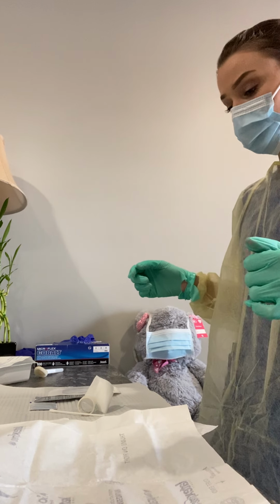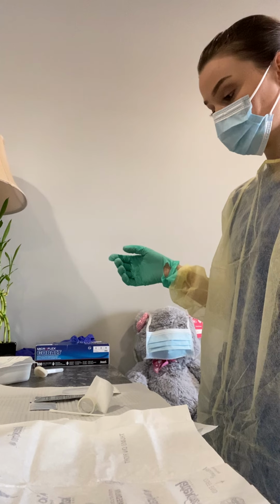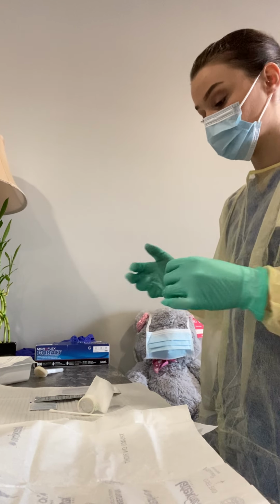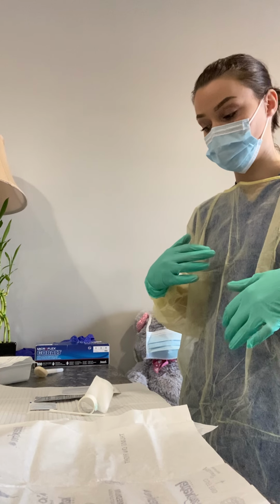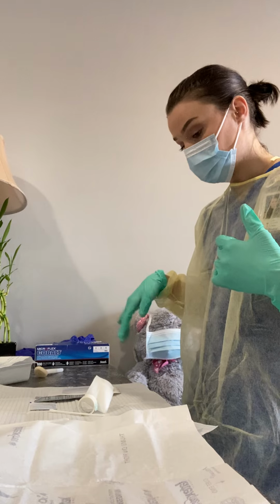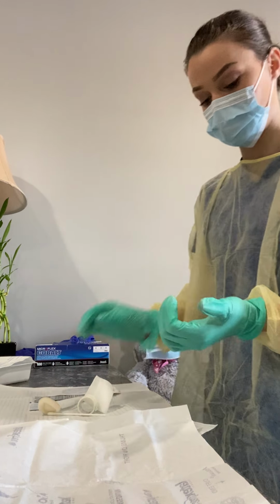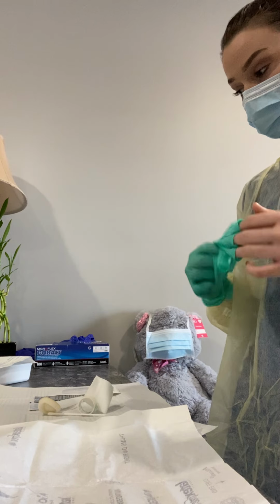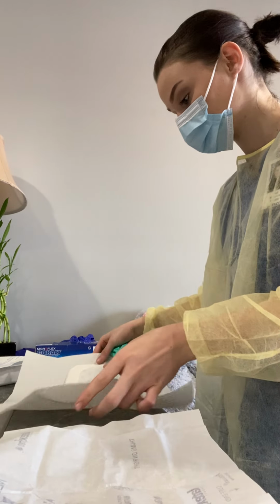If she would have had any drainage on the dressing, anything that needed to be reported, I would report that. And then also document my findings, document that I changed the dressing. So that's it for that one. I'm going to go ahead and clean up this area. I don't have a whole lot of room to work with.